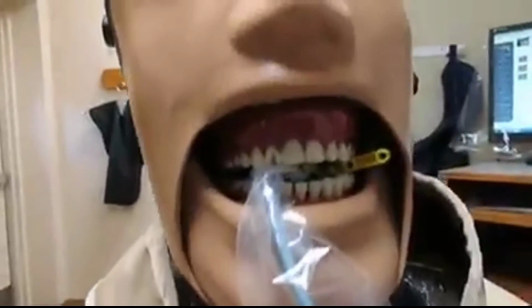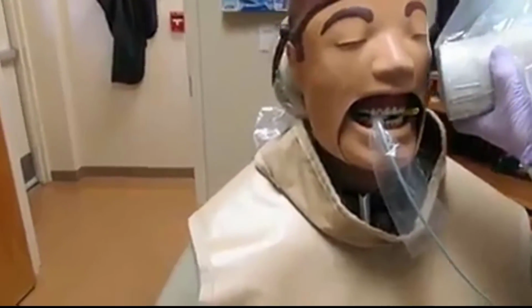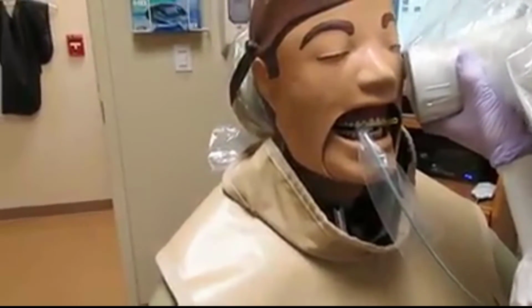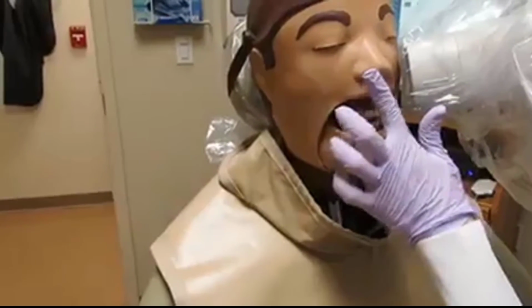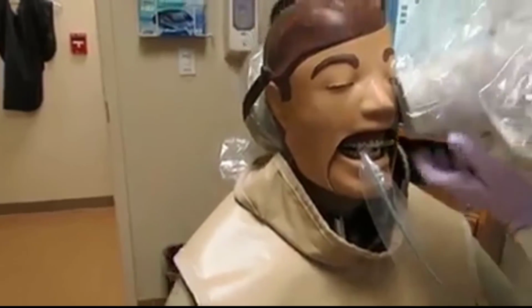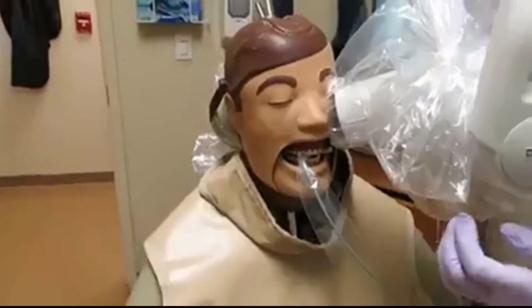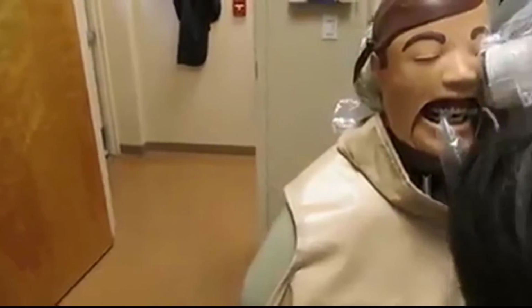For the maxillary premolar exposure, once the receptor has been placed, direct the central ray through the roots of the teeth by having the PID pointed below the pupil of the eyes and the vertical angulation of plus 30 to plus 40 degrees. Place the central ray through the contacts of the teeth and cover the receptor with the tube head.